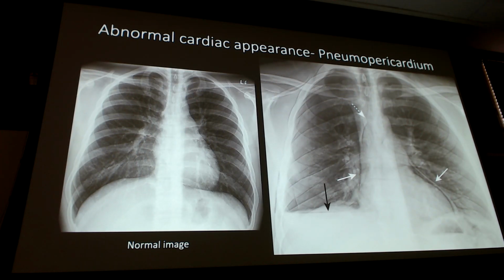Okay? Likely I need a CT to really pull out, is that a rib fracture there? Maybe, right? But then I've got the medial border of my scapula here, so that's the medial border of the scapula. These could be skin folds too. I don't know. I need to see the patient to really know. But this guy right here, definitely my pneumothorax. So it wasn't that the air got from there into the mediastinum that was also pericardium that was simultaneously damaged.